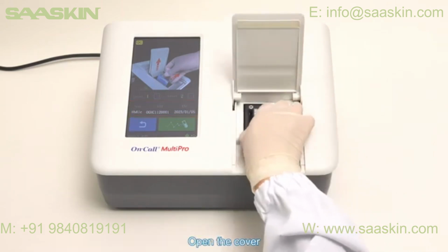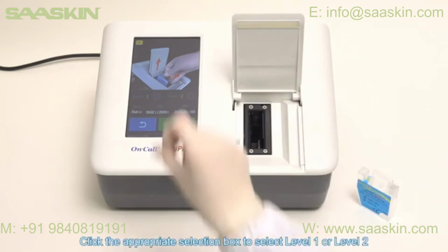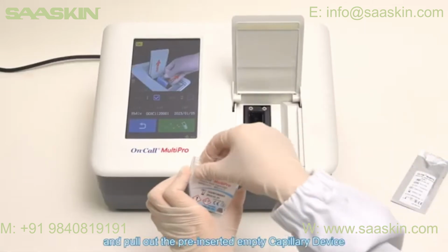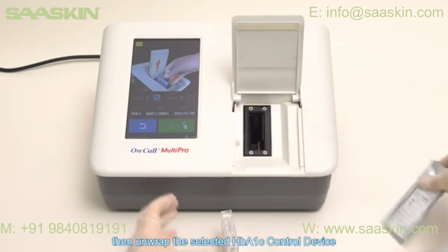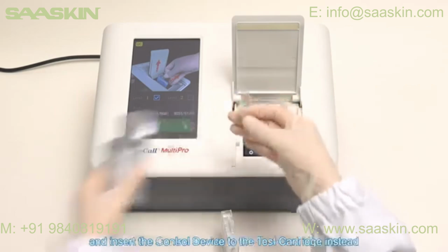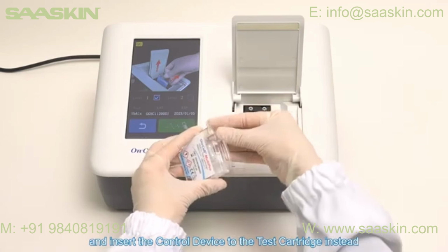Open the cover. Then remove the control ID cartridge. Click the appropriate selection box to select level 1 or level 2. Take out a new HbA1c test cartridge and pull out the pre-inserted empty capillary device. Then unwrap the selected HbA1c control device and insert the control device to the test cartridge instead.